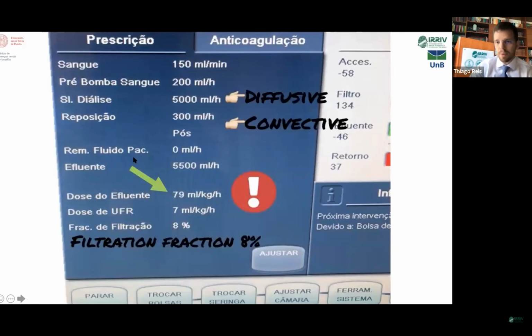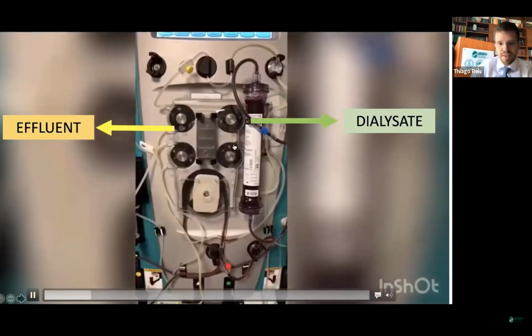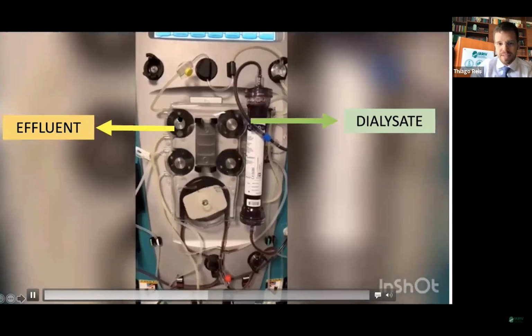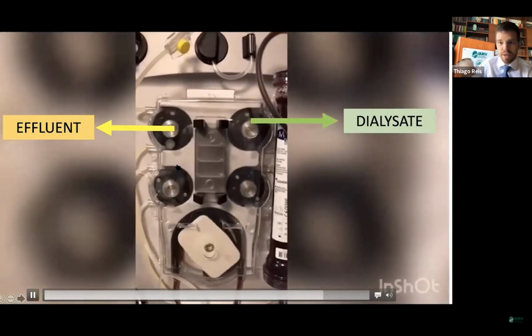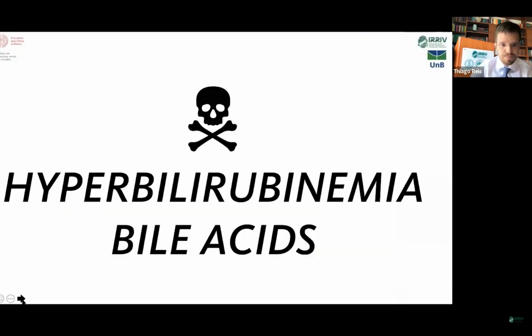And this is an example in the machine. Here is the dialysate flow, 5,000 mL per hour, replacement only 300 mL per hour, and an effluent, in this case, of 79 mL per kilogram per hour. So diffusive clearance mainly. This is the representation in the machine, so you can see the pumps for dialysate and effluent spinning fast with that high dose.